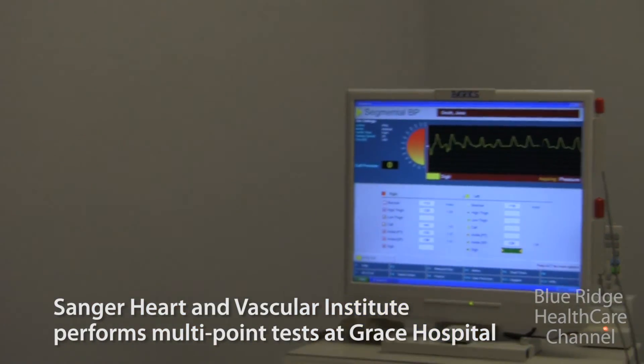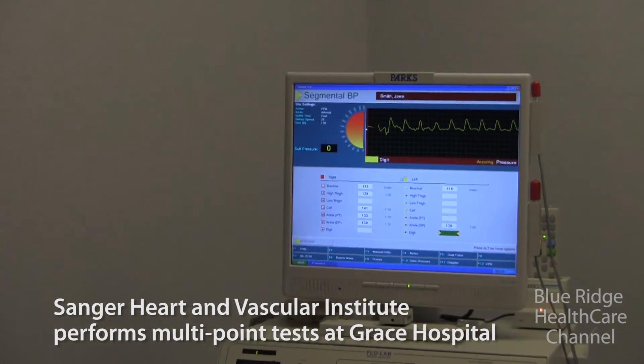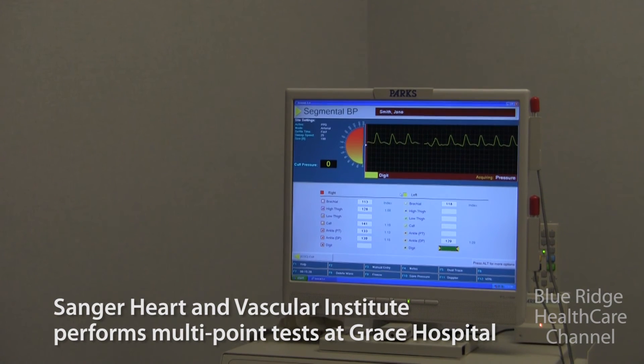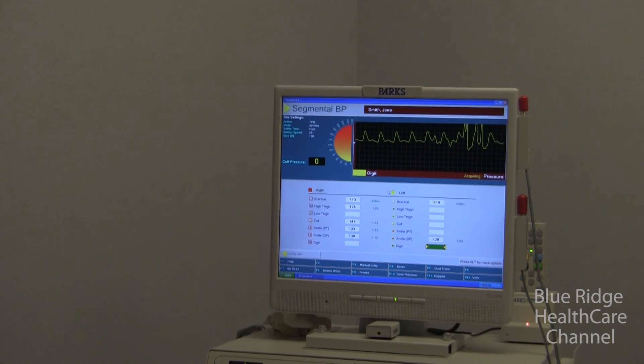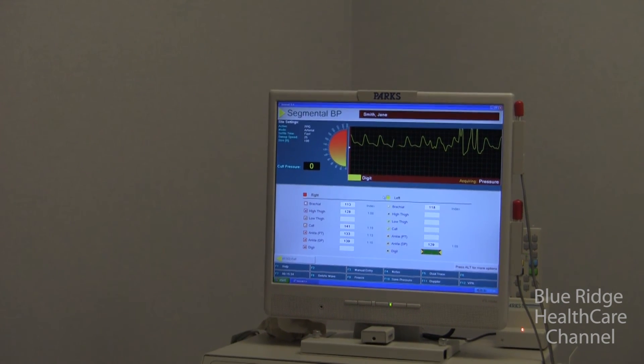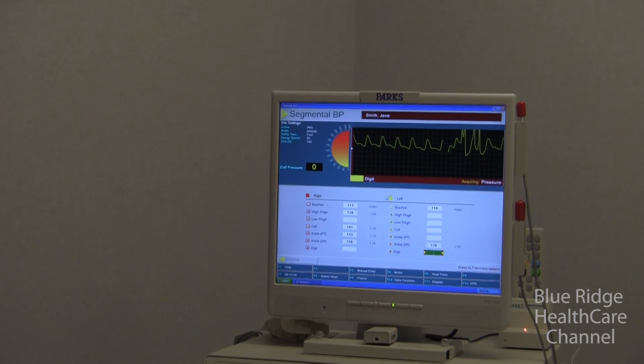This sensor is so sensitive that if we move it actually picks up the movement. There's the toe trace — see how it responds when I do this? That's her toe trace.